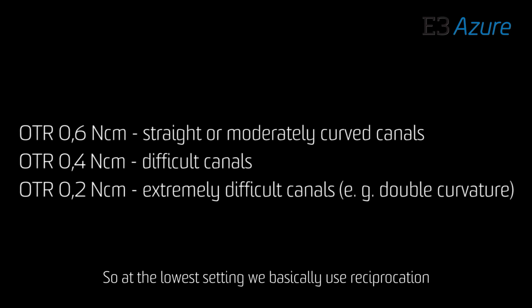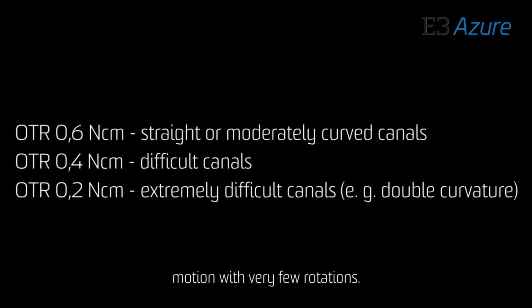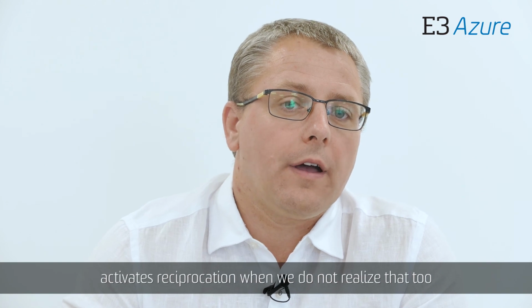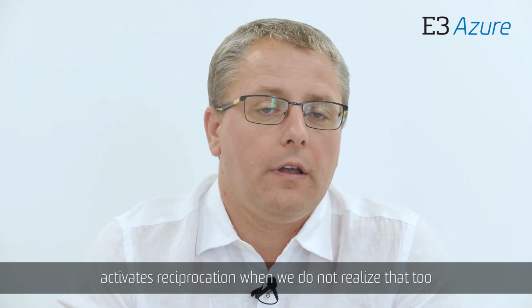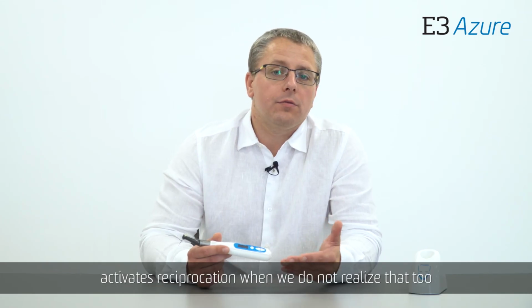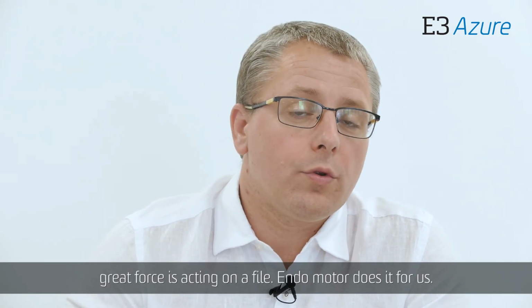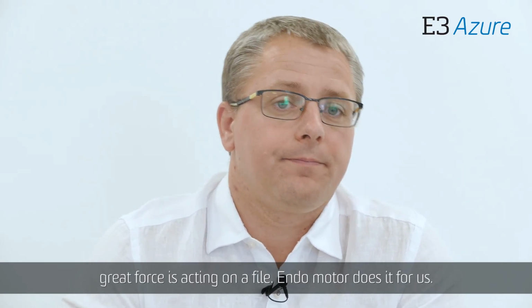So at the lowest setting, we basically use reciprocation motion with very little rotation. So OTR we can count as an intelligent rotation which activates reciprocation when we do not realize that too great a force is acting on the file. The endomotor does it for us.